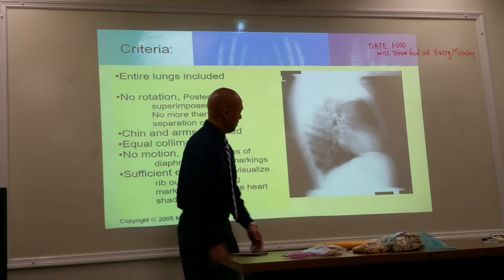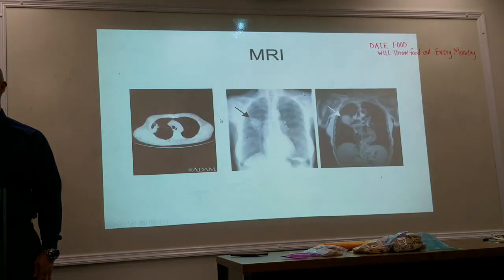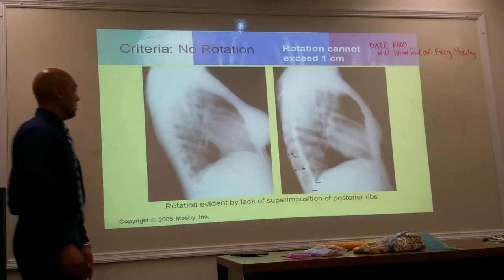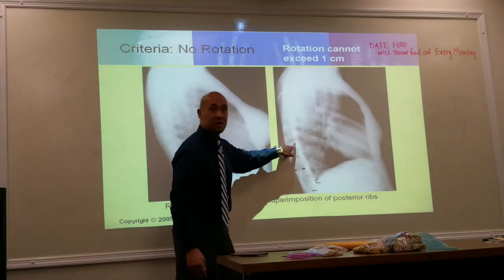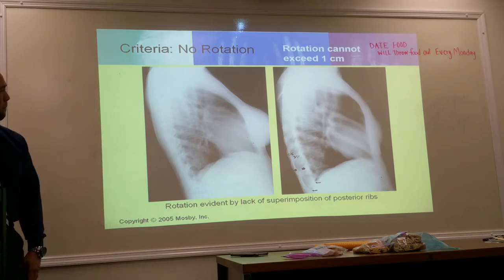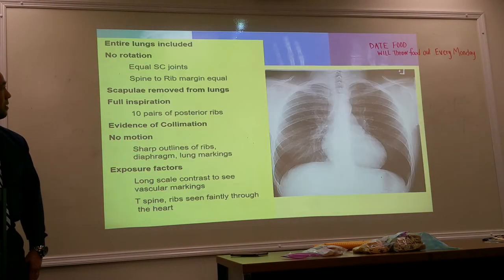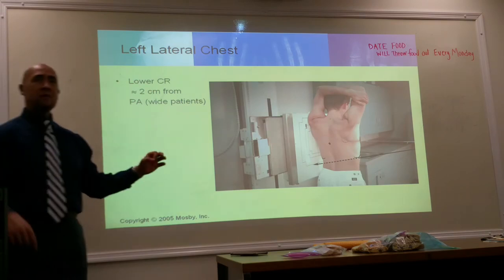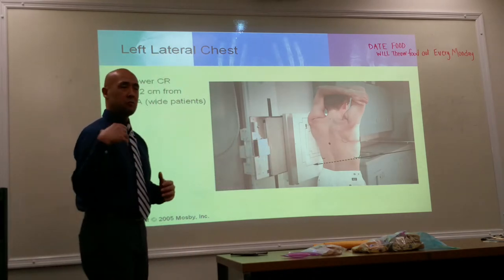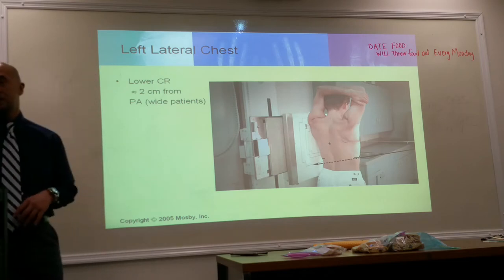It's superimposed. They're superimposed. Unlike this image here, where it's obvious that there is rotation, which is right way back. Right there. See, one set versus two sets. You only got one set here. All right, any questions about dropping the image receptor and the tube about half an inch to an inch? And then from the lateral, we're also gonna move the patient right side slightly forward to accomplish that one set of posterior ribs, okay?